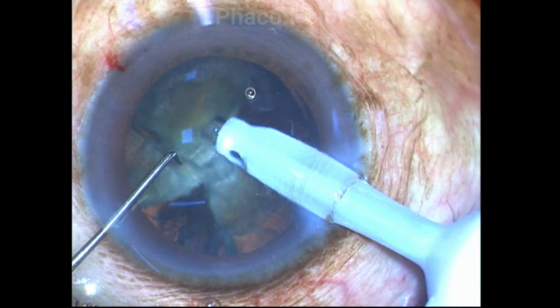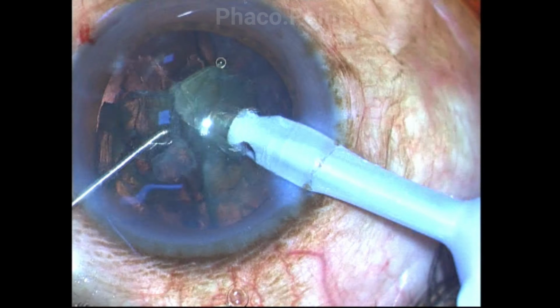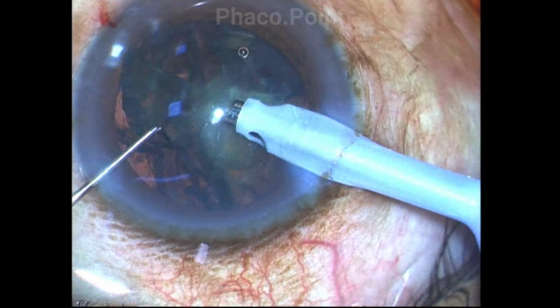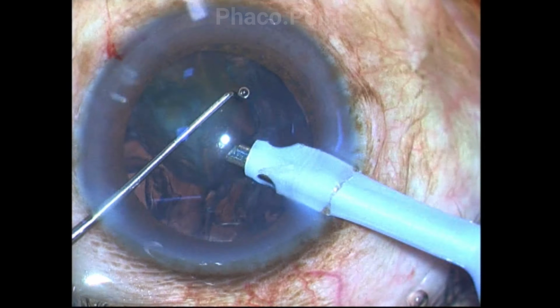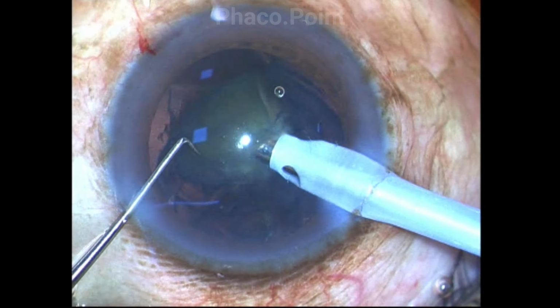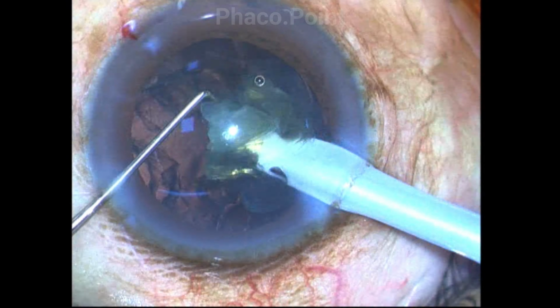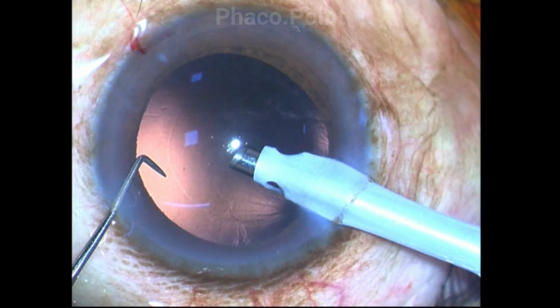manner emulsified. So the surgeon buries in 3, brings up in 2, back to foot pedal 3 to emulsify and then 1. If there are bits of epinucleus that are flying around, they are aspirated in foot pedal 2. The last fragment is then turned around, impaled, brought up and then subsequently downsized and emulsified until the completion of nuclear emulsification.